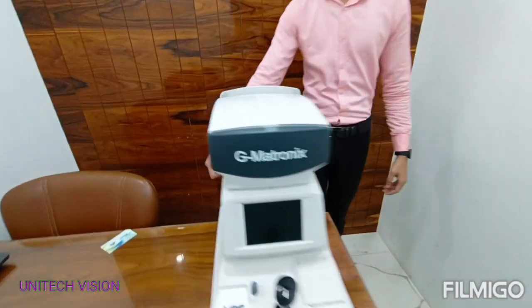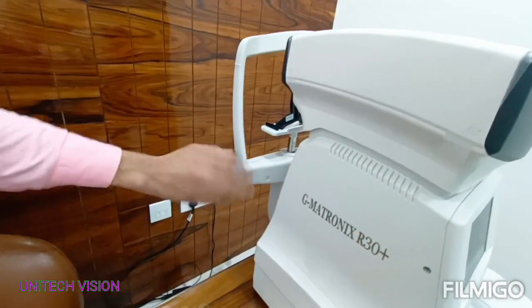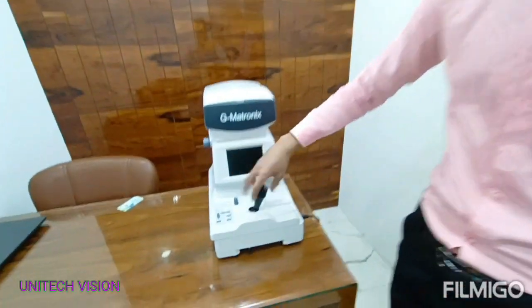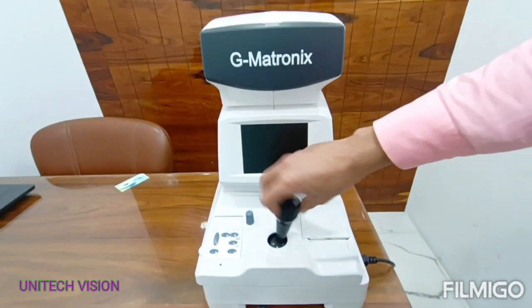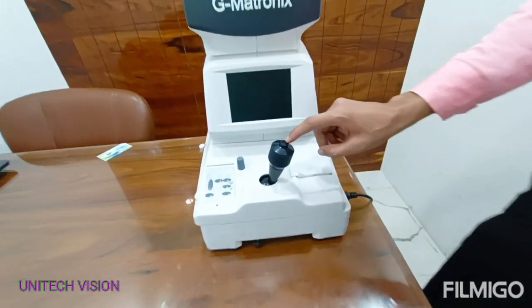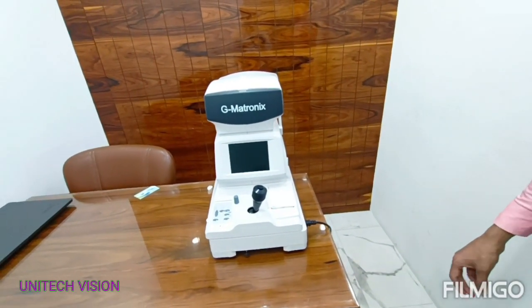Chin rest knob for up and down chin rest. You can move the head up and down with the joystick. With the measure button, you can take 9 readings in manual mode, and it will automatically take 3 readings in automatic mode.